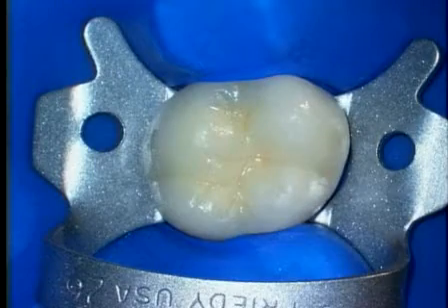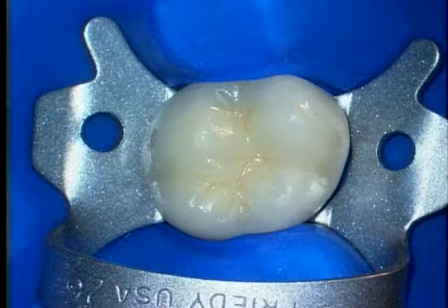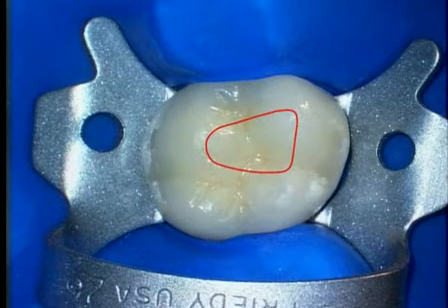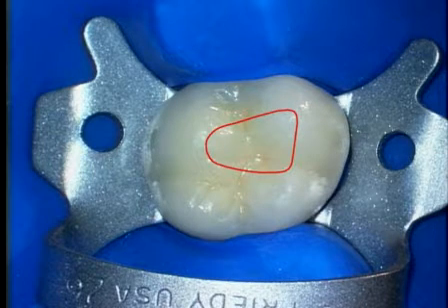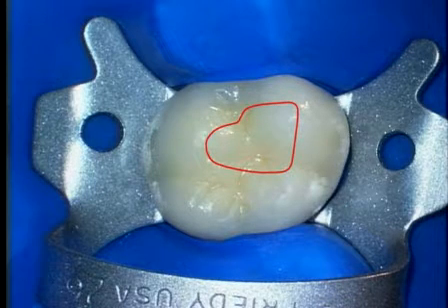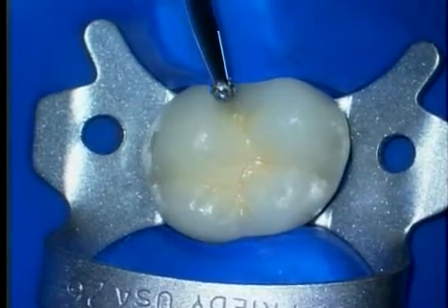Again, we're looking at the occlusal view of the isolated tooth. In this instance, it's a porcelain fused to metal crown. The outline pattern guides our clinical actions, but in a maxillary first molar, we need to be aware of the presence of the MB2, which is present over 90% of the time. Therefore, our access cavity needs to expand at the expense of the mesial marginal ridge.